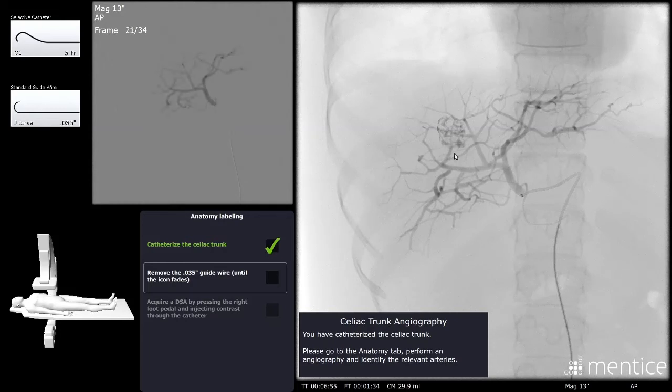In DEB TACE, or doxorubicin-eluting beads, there are small particles that are used that get distally out. There are small particles that infiltrate the tumor bed, vascular bed. So the idea would be to get your microcatheter to the point where you are sure that you have covered all the arterial tree. You would then inject whatever chemical substance or embolic that you use.